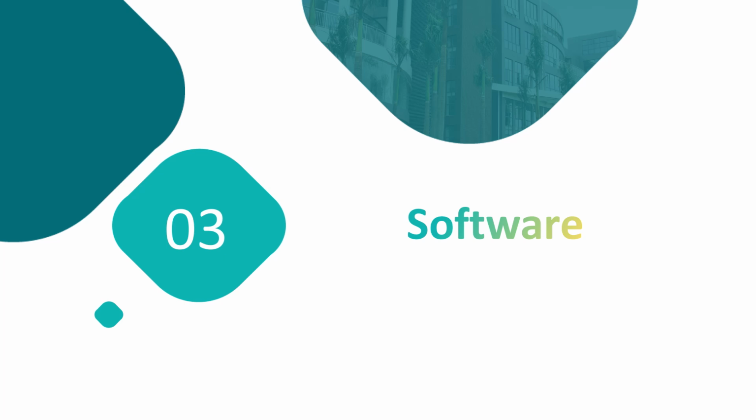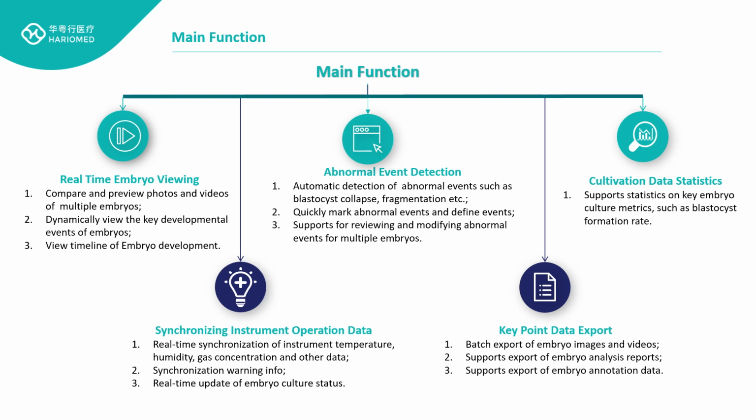So next, I would like to introduce our software. So the main function of the computer software including data sync for instrument operation and be stored and viewed in any computer that connected to the server at any time. Real-time embryo viewing, embryo abnormal detection, and if it is not acceptable, so the record can be modified as well. And then key data export like culture events, pictures, videos. Cultivation statistics. You can view and count the embryo cultivation performance in the laboratory to see the performance for that period.